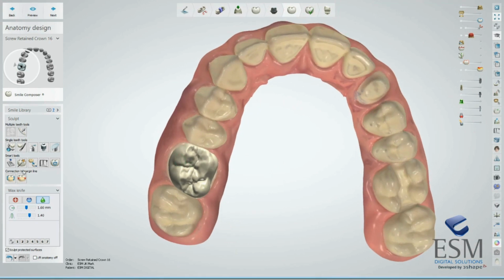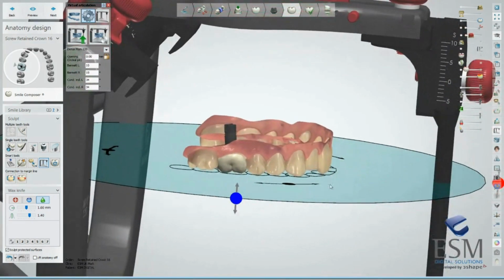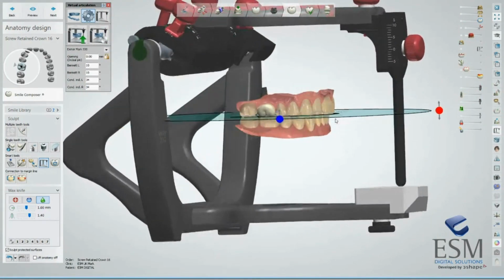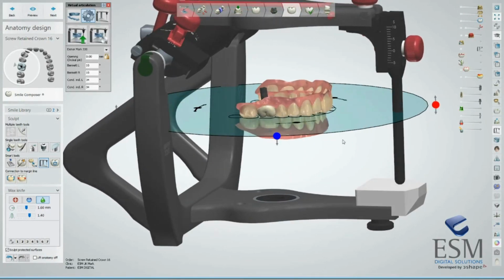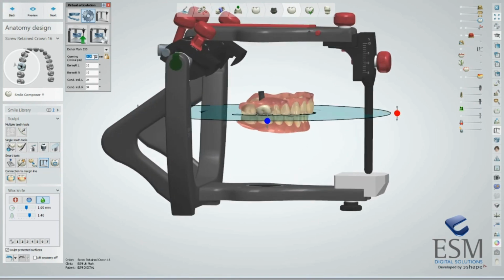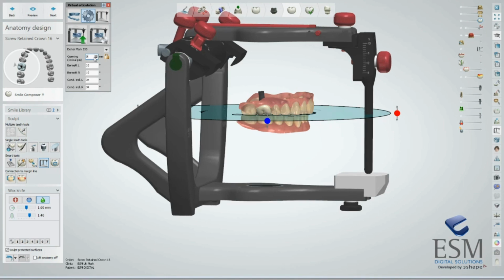Also, we have our articulator in here. So what we can do is I can click onto that, and then it will give me a schematic of our articulator. We'll just place the lower on as well. The articulator, we can move that. We can just move that to get where we want it to be. And then we can also, if needed, open the bite if we wanted to. So if I actually change that to 2 millimeters, you can see that the schematics of the articulator will update. Again, leave it at 0.